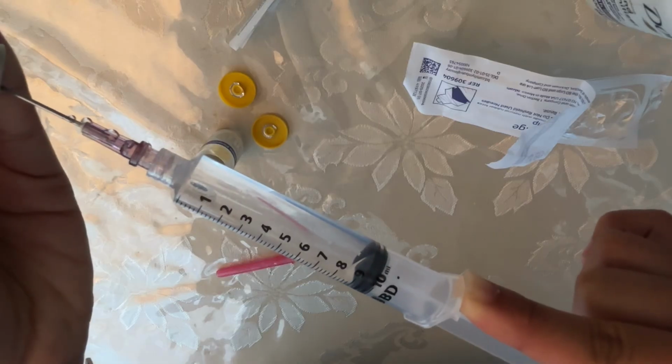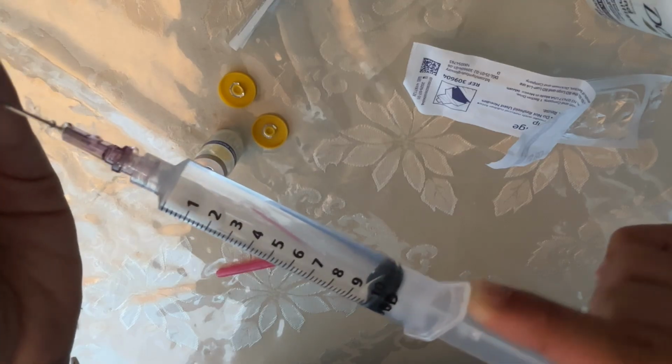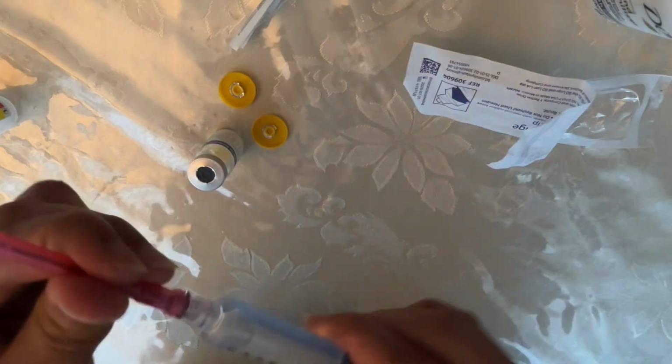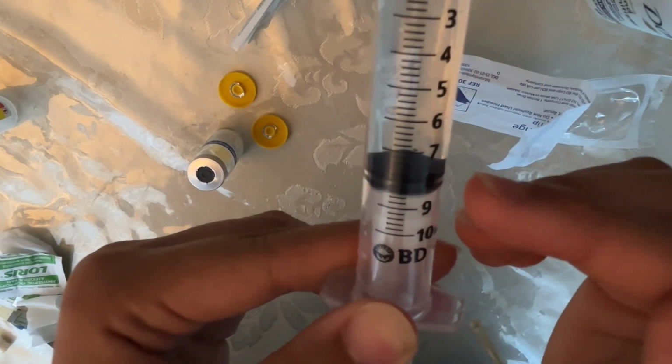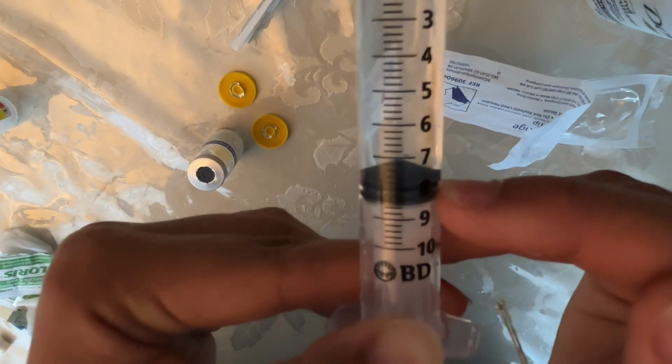So I see that I have a big bubble, so I'm just going to draw more than needed to remove the air bubble. Tap with one hand and tap to remove the air bubble. So make sure that I have 7.7. Now I have 7.8, because it's hard to get 7.7. Just one line above 8 ml.